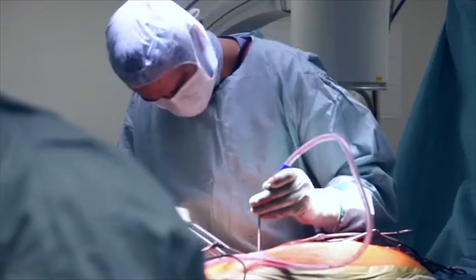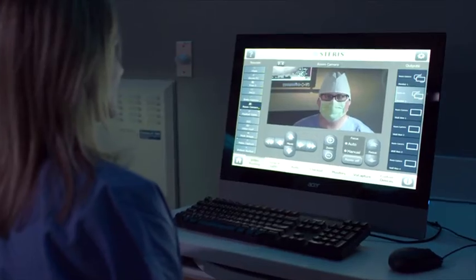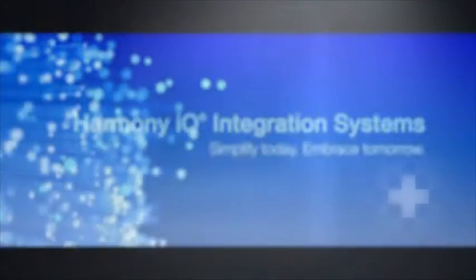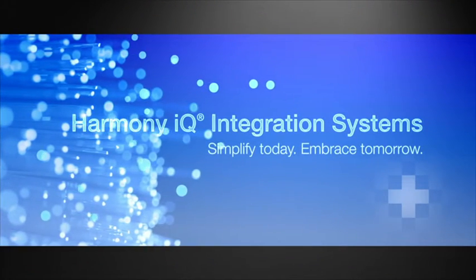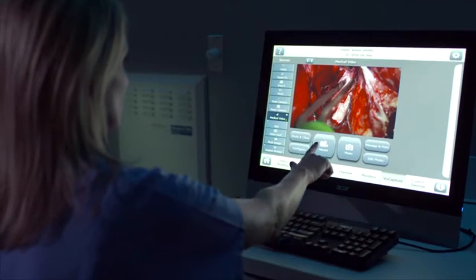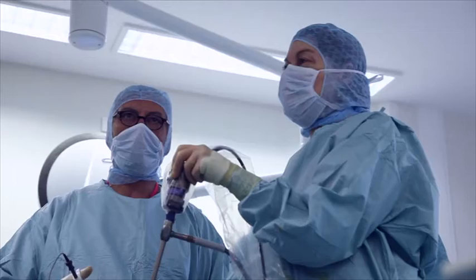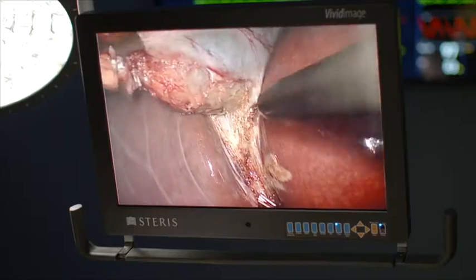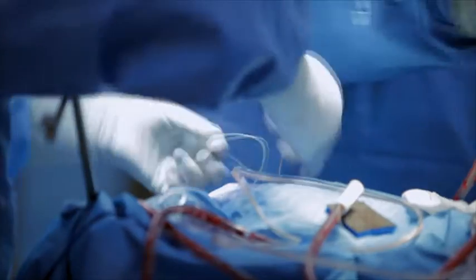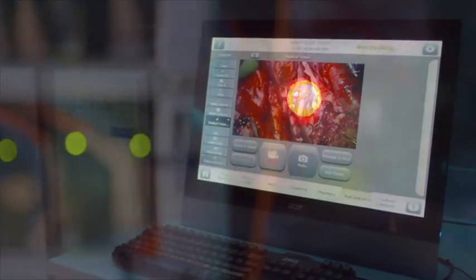OR integration is about intelligently managing the workflow in the OR, incorporating the equipment, electronics and communications into one efficient system. Our approach to integration goes deeper. To us, integration is about improving patient care — giving healthcare professionals the tools and technology they need to maintain their focus on caring for the patient.